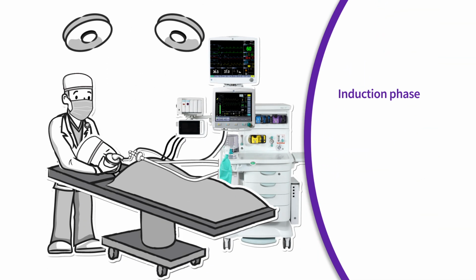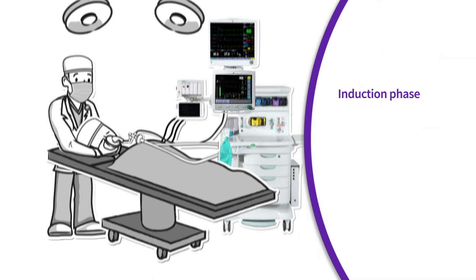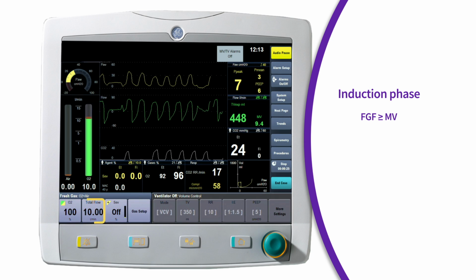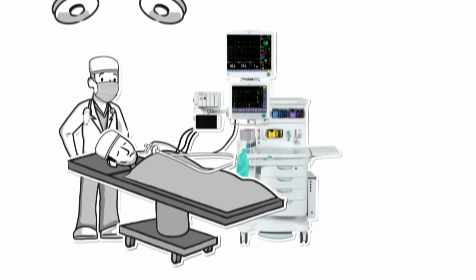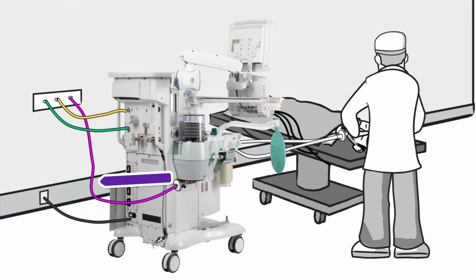During induction, the anesthesia provider may employ high fresh gas flows between 6 and 10 liters per minute. For most patients, this high fresh gas flow may meet or exceed the patient's minute ventilation, thereby reducing or eliminating the need to rebreathe any exhaled gases.